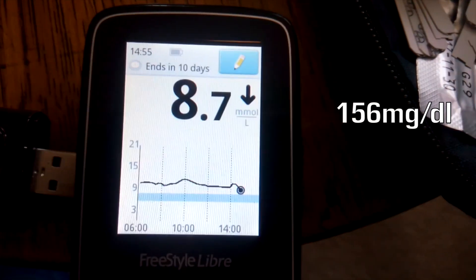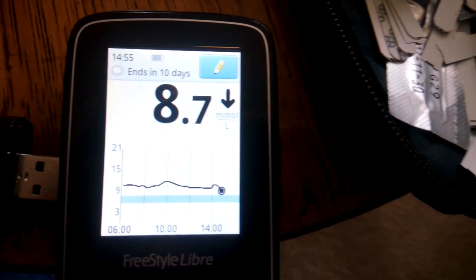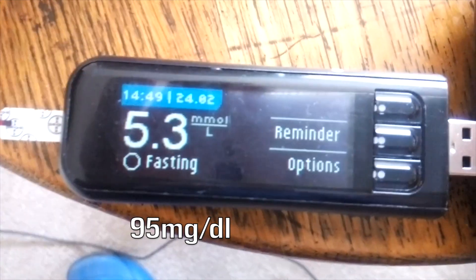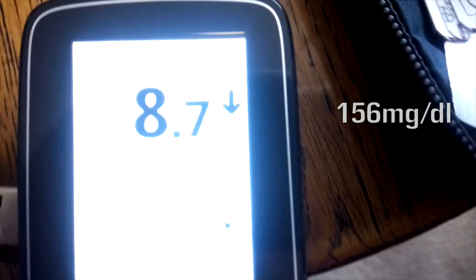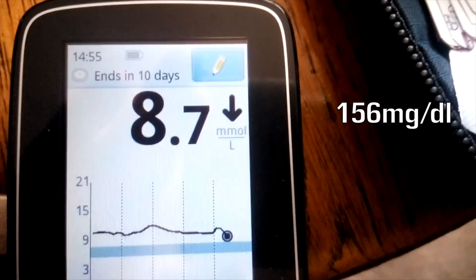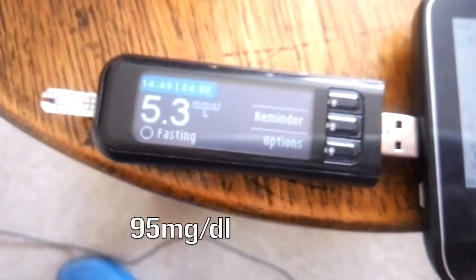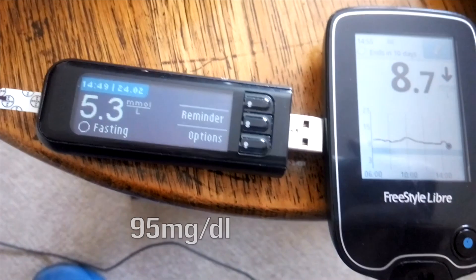This is the reason it's a good idea to double check with a blood test after exercise when using the Libre. The blood test says 5.3, but the Libre says 8.7 going down — and literally about a minute ago when I was actually on the run it was showing 9.8. So it's very important to take that into account when doing exercise.